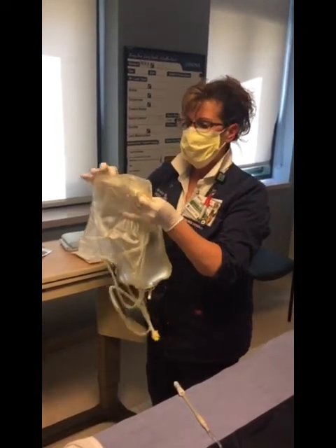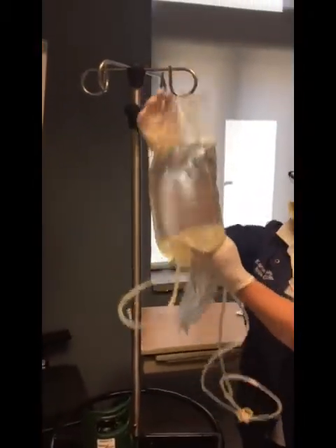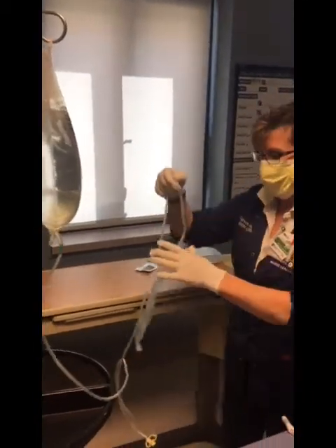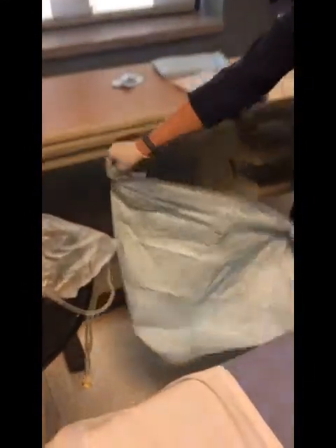The containers come all in one. You open it like a normal IV bag and it's all connected — you've got your fluid and then your drain bag. You set this on a pole and get all your stuff situated.